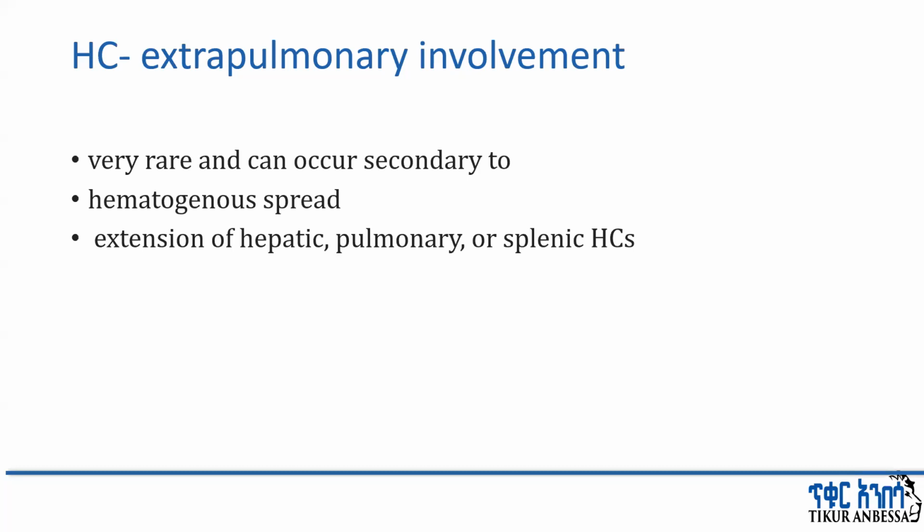Continue. Okay. Now we have covered lung, we have covered cardiac. Let's see hydatid cyst extrapulmonary involvement, which is very important and which was not covered in some other area.